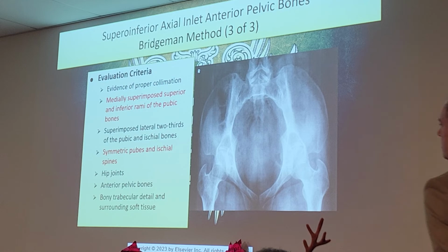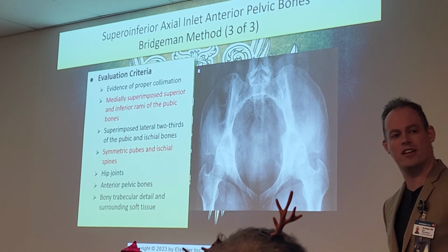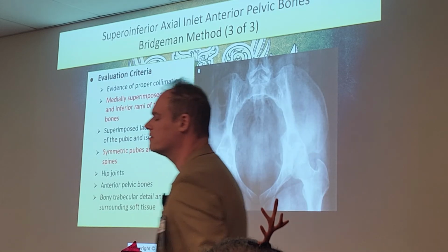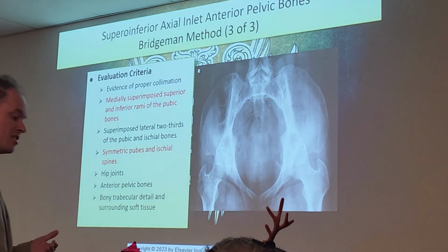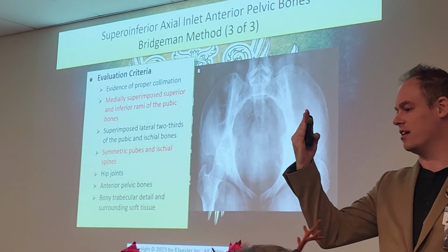Is this a female patient? That is a good question. Can't really tell because we can't get a good visualization of that outlet. Can't really confirm that. It's going to elongate on both because we're adding that angle, so there's not really a way to determine based on the inlet because they're both going to be vastly elongated with this view.